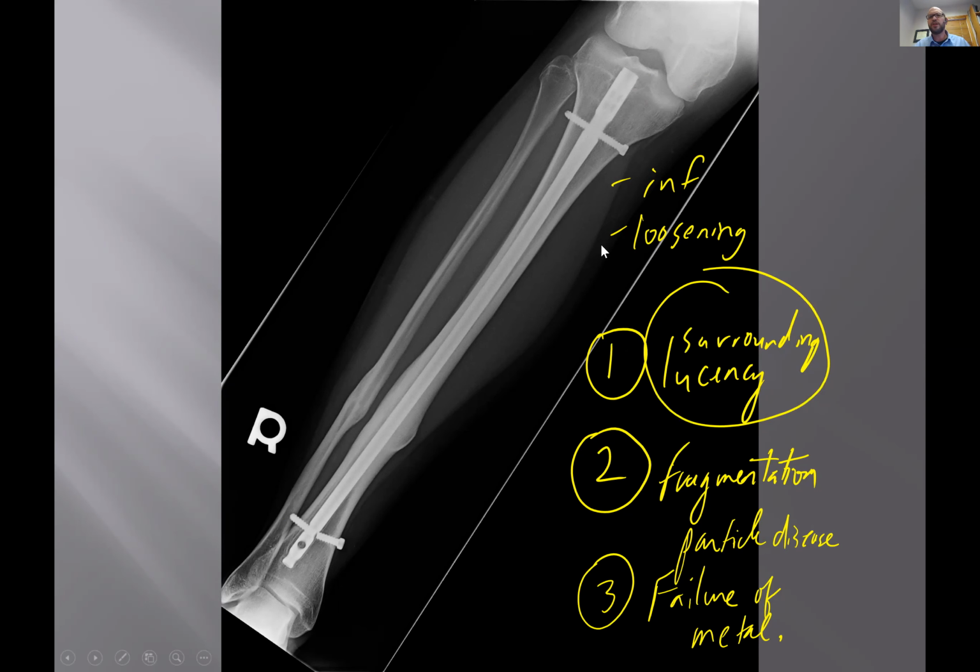Are you still hearing me? Yeah, I guess that's the reason for my question. When you ask the question, is this a surgical failure or not? To my mind, it's not a surgical failure, it's a component failure, but at a point where it has no medical significance regarding the issue that you see. Yes, that's a good distinction. The surgical failure broad category should be defined very carefully here as a component failure. It's not a problem with the patient, it's a problem with the component. Good point.